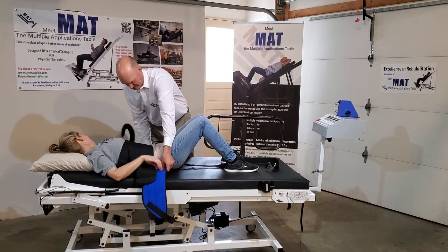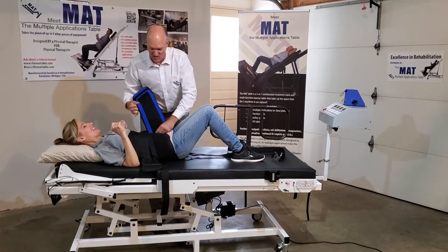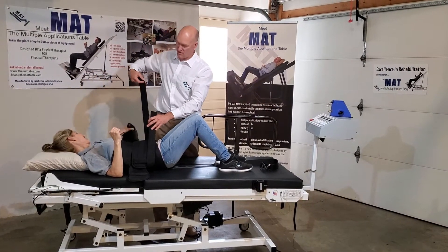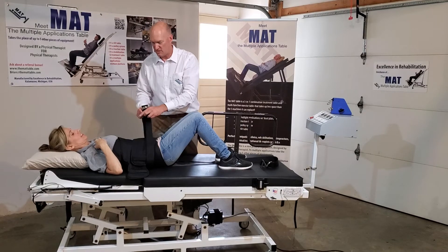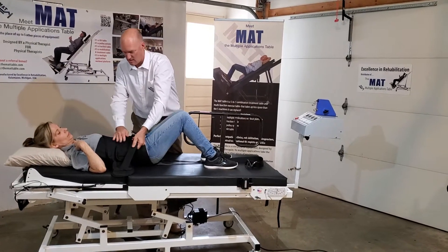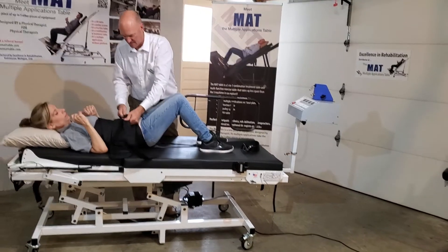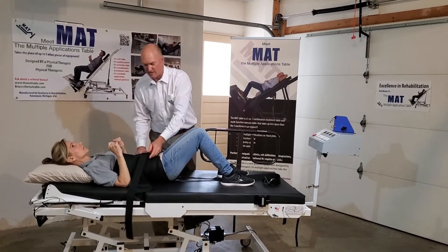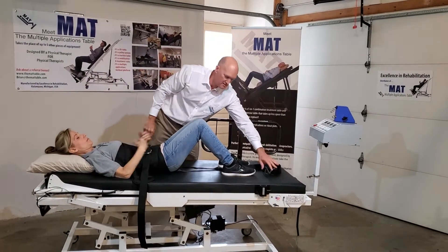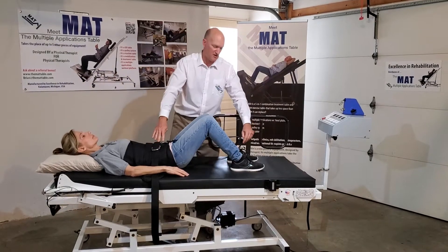Now we'll apply the lumbar belt. Is your dog part of the therapy? Well today he is — no extra charge. Once the lumbar belt is applied you have to put on the additional belt which tucks through this way. I'm going to slide this around because patient S is slimmer than the last patient. This is the most important part — tighten as much as you can. Is that too tight for you? It feels good. That will be where the traction load is applied.